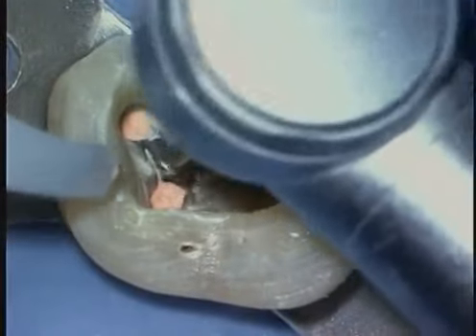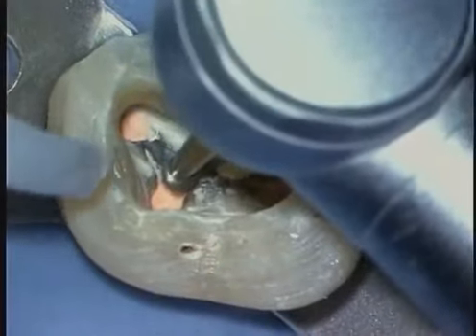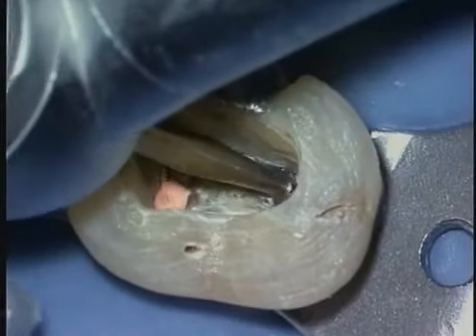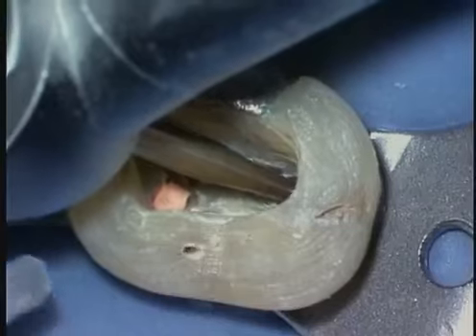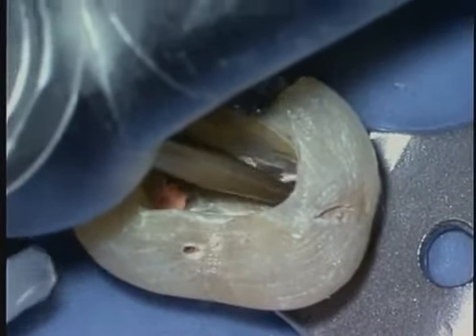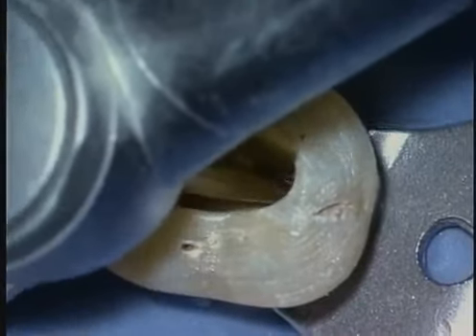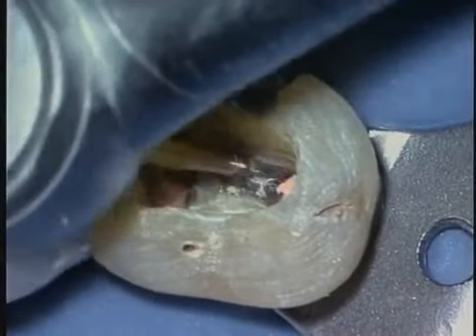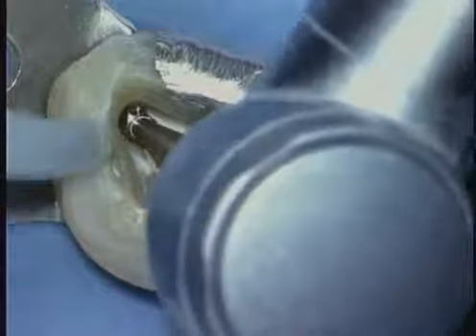I like to take the gutta percha just a little bit suborifice level, just bump the rheostat and get a little rotational speed, being careful not to cut dentin. And by removing gutta percha and getting it off the orifice levels, you begin to see the pulpal floor in its entirety, and you can begin to appreciate the relationships between orifices.